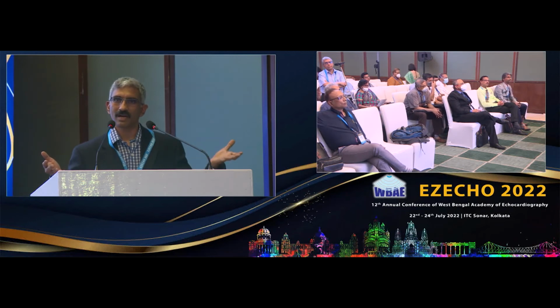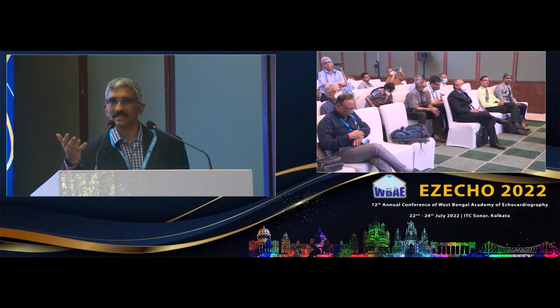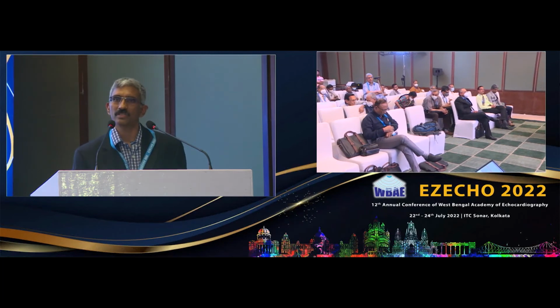What I don't know, and I'm trying to understand myself, is the significance of the volume of scar burden or edema that you see only on the maps, as compared to the significance of the volume of scar burden that you can see visually on your delayed enhancement examination. Because these are more subclinical. I maybe shouldn't be using the term subclinical because obviously they're presenting with symptoms. But the quantification is clearly less because you're not even seeing it on your routine imaging. So I'm still trying to understand in my mind how that translates into long-term prognosis. But the main reason is for us to see the distribution, which you don't see on a normal view.